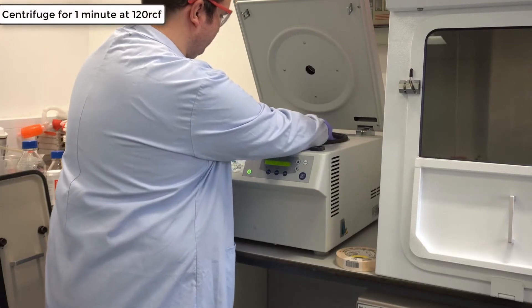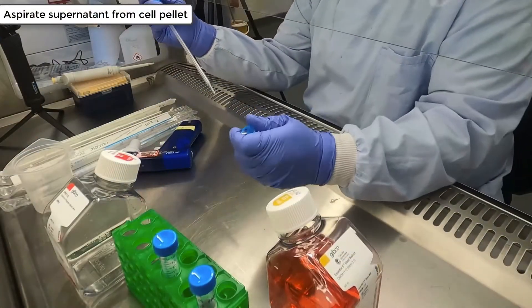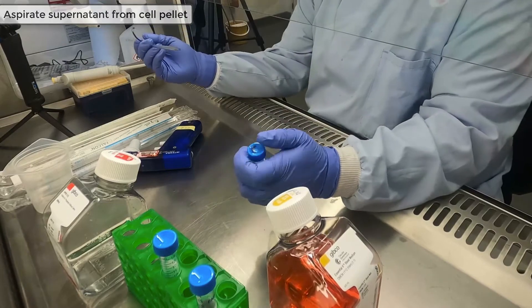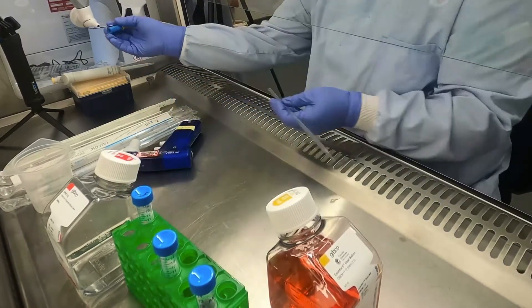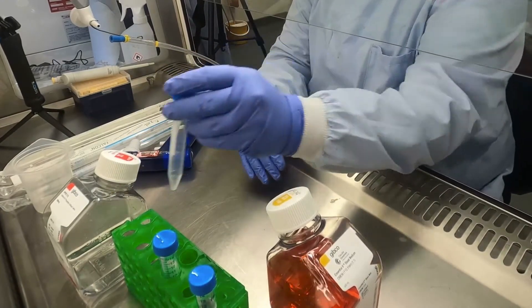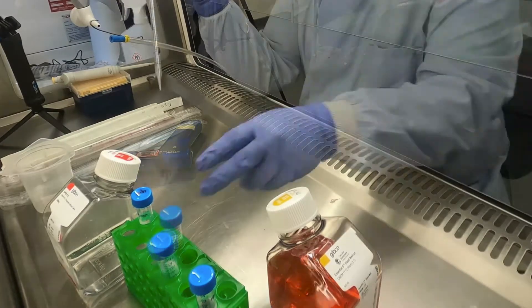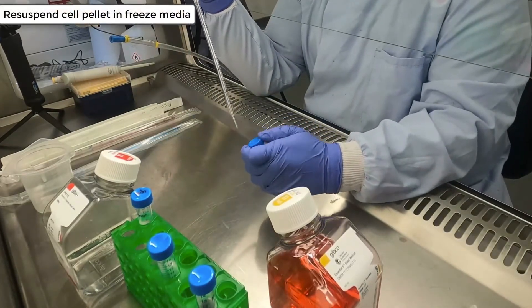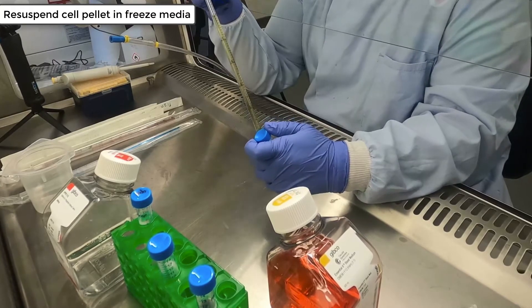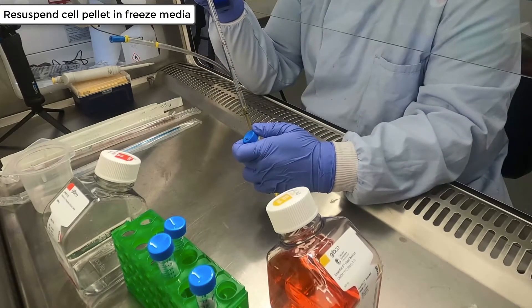The cells are then centrifuged for 1 minute at 120 RCF. After spinning down the cells, aspirate the supernatant from the cell pellet. It's good practice to gently flick the cell pellet to initially break it up before adding any freezing media. Since we are freezing 6 cryovials, in this case we are resuspending the cell pellet in 6ml of freezing media. Resuspend the cell pellet gently until you can't see any visible clumps.